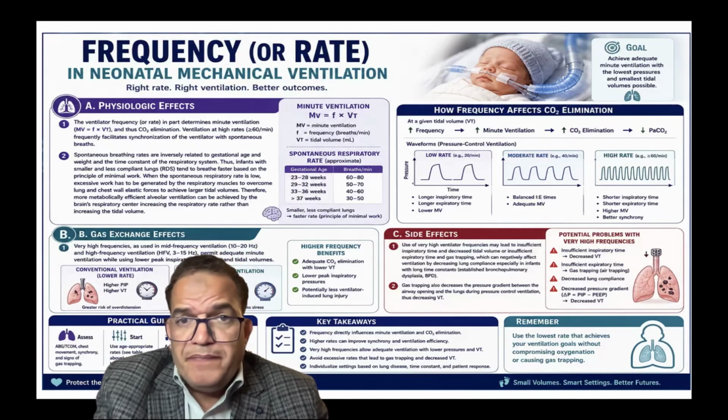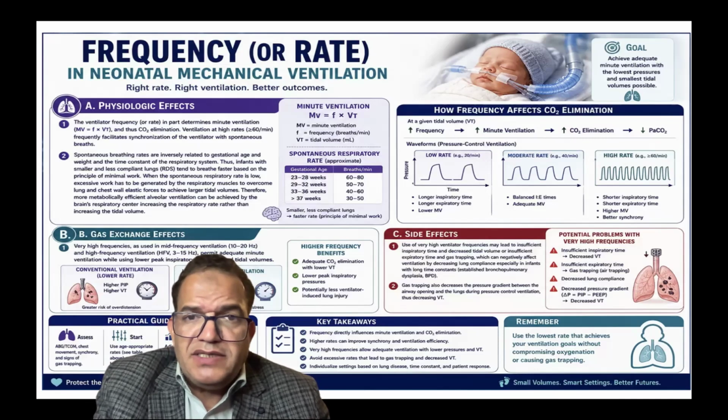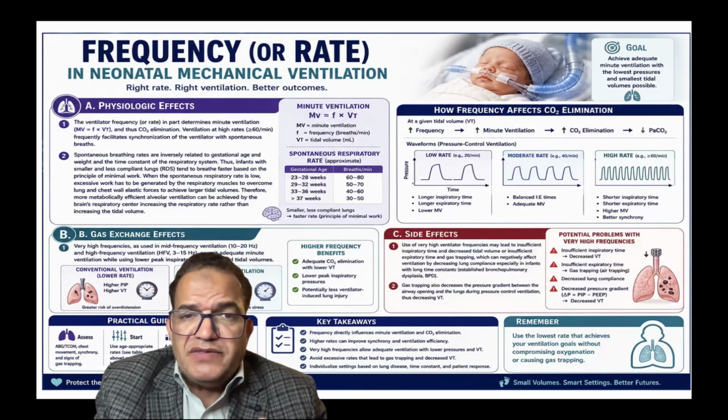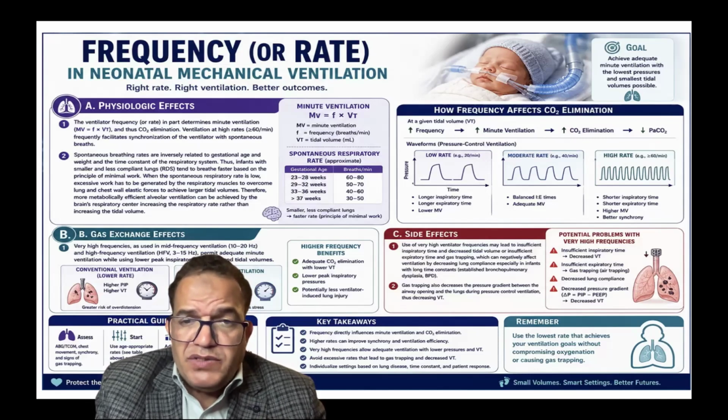In conventional ventilation, you give the rate, but the rate itself is not an injurious thing. It doesn't mean that if you give a rate of 60 or 70, the baby is injured. What will happen is that the volume which you deliver by the pressure has the main influence on the trauma. The rate's benefit is minute ventilation, improving the CO2 elimination.